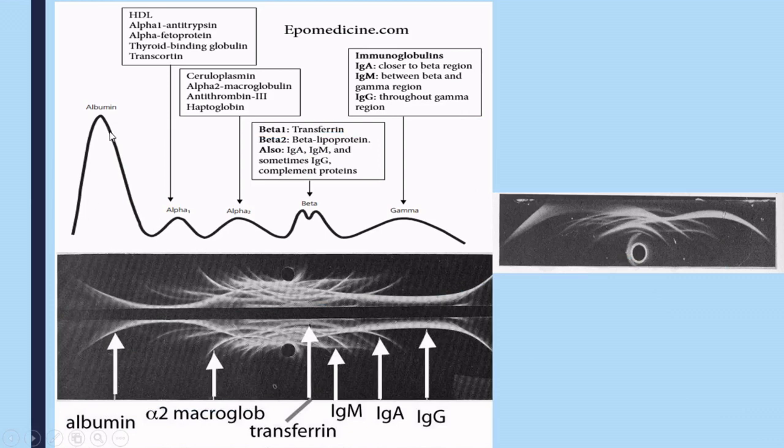And if you know what is the exact arc that albumin should give, or alpha 1, or alpha 2, or beta or gamma should give, then you will be able to get those arcs, mark them, and note whether they are following their exact location as per the healthy immunoelectrophoresis, the healthy sample or antisera. So you would come to know whether your antigenic mixture, here for example the plasma, contains an appropriate amount of proteins or not. So this is how we can comment about the relative concentration of serum proteins or plasma proteins and qualitatively detect their presence.